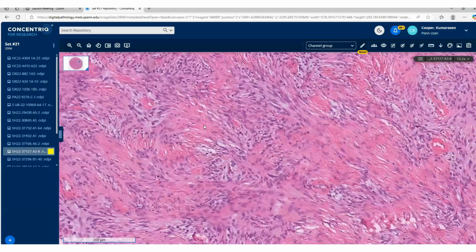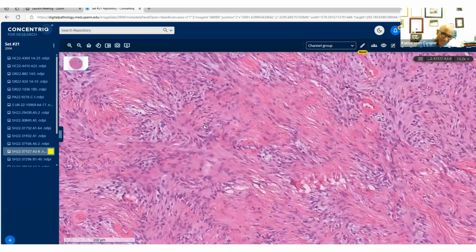Can it be a low-grade fibromyxoid sarcoma? Yeah, that's a good thought. That's a very good thought. You've got spindle cells and you've got the sclerotic areas. When I see myxoid areas in a spindle cell tumor, I always do the MUC4, always. So we did do the MUC4 here, and MUC4 was negative. So again, just looking at spindle tumors here, bland looking with this variegated pattern with small foci of myxoid areas, other foci of more sclerotic areas.